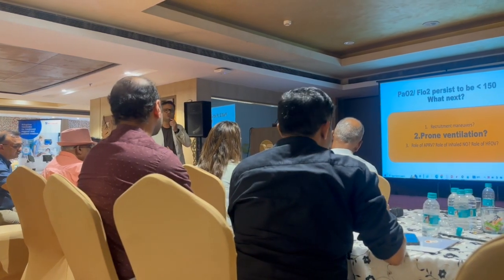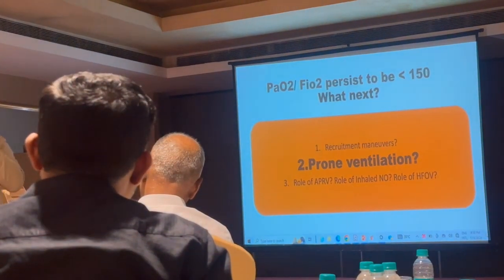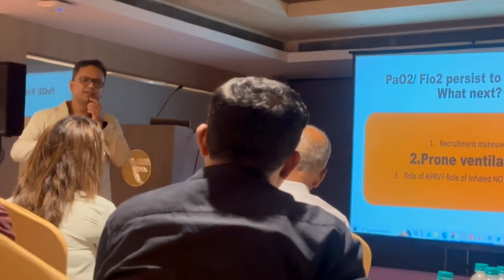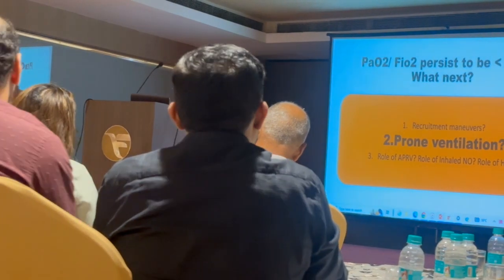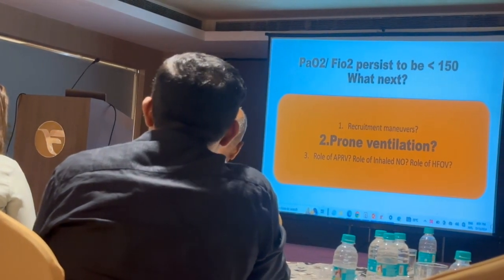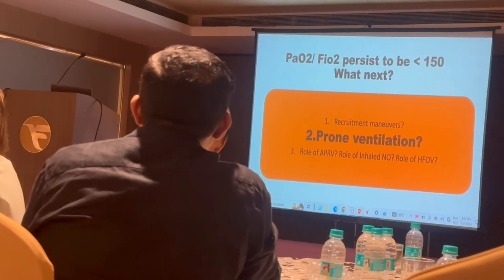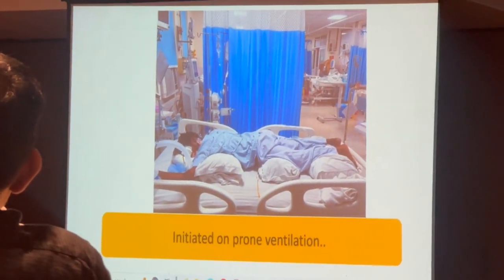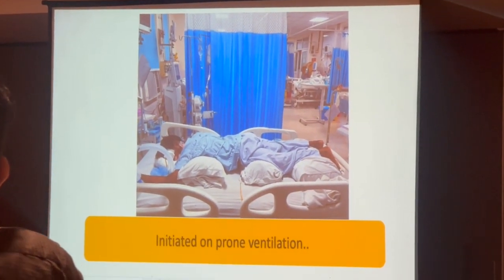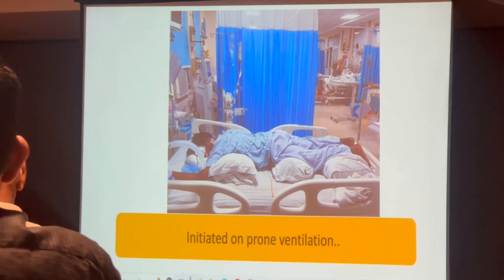So anyway, the PF ratio continues to be less than 150. What do you do if the patient is persistently hypoxemic, we saw airway pressures, you did pleurocentesis, you optimized the fluid, driving pressures are still on the high side? How do you recruit them? For recruitment, we used to give high PEEP to the patient, and still just for prone ventilation, we used to initiate the patient. So the point is that if you find the patient is persistently hypoxemic, rather than doing any specific recruitment maneuvers, you should use more of prone ventilation, which itself is a recruitment maneuver, right?